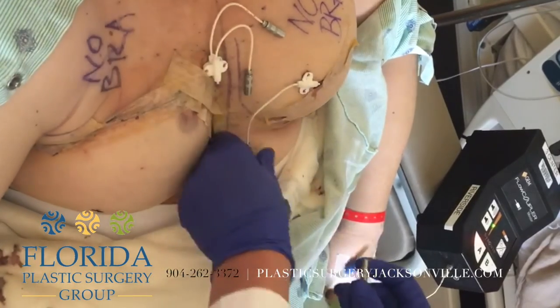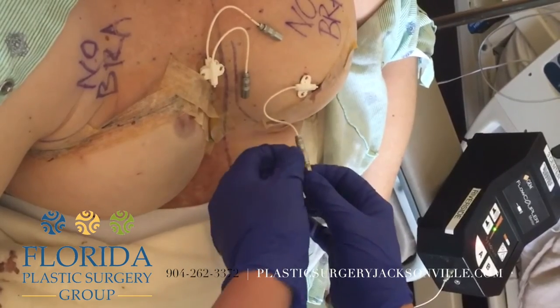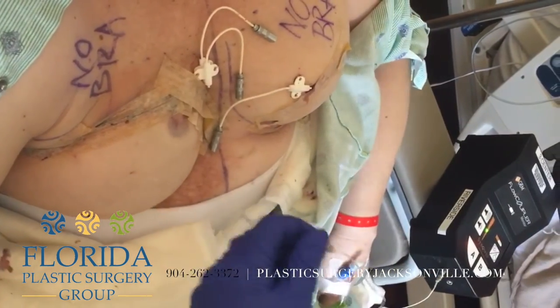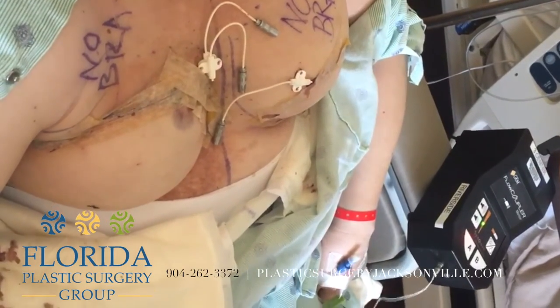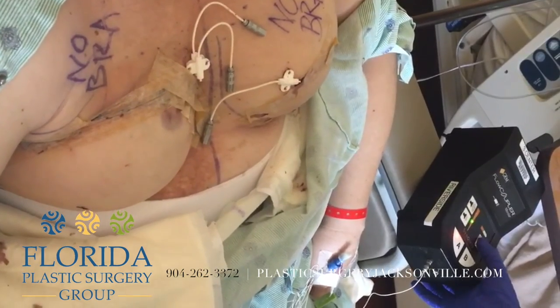And you can hear a sound change — check this one too. Those are all normal sounds. As long as you hear something, it's usually a good sign. If you hear nothing at all, that's when you should call the doctor and be worried.